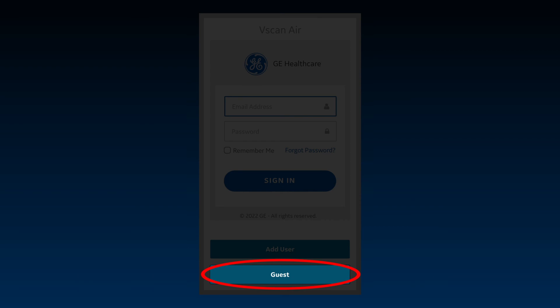Guest mode allows the user to scan without having to sign in. This is available on apps that have already been registered and allows immediate access to the scan functionality when time is critical or in case of any temporary challenges with signing in. Note, guest mode allows users to scan with already registered probes and save images. The ability to view previously acquired exams is not possible and scanning is supported only for registered probes in apps.